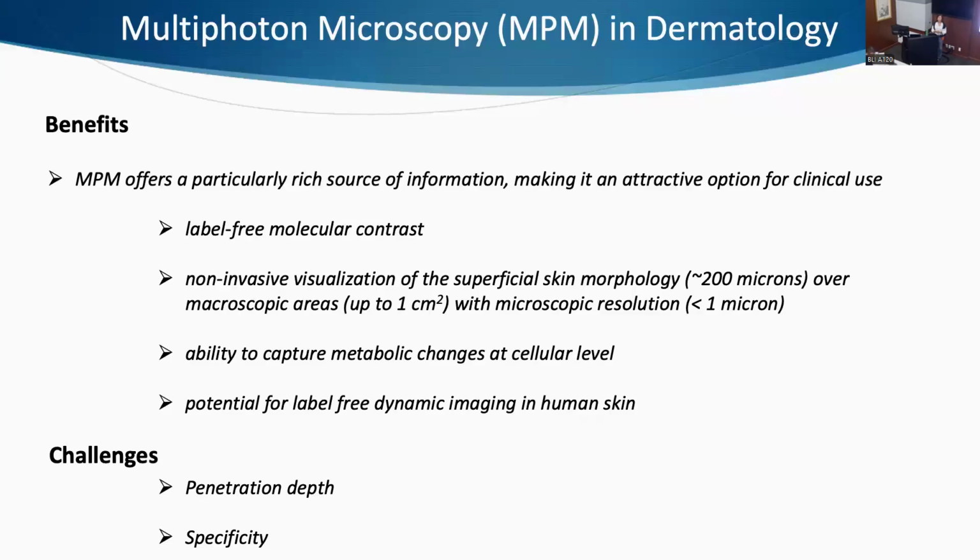So the components from the principal component analysis are literally the skin components, and that involves, Alex will be able to explain, some guessing, right? In the way we assign those clusters to different skin components.